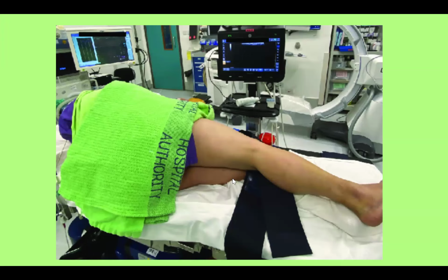And then ergonomically, you'd want to be on the side of the patient and having the ultrasound screen, if you've got the butterfly probe, either on the same side or positioned somewhere so you're positioned quite ergonomically, and this allows a nice lateral access or lateral approach to the nerve.